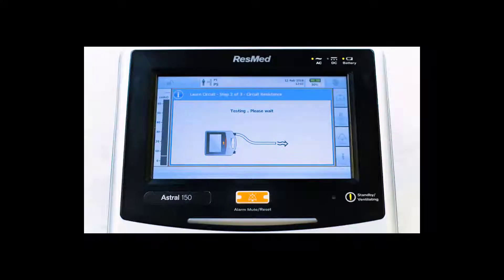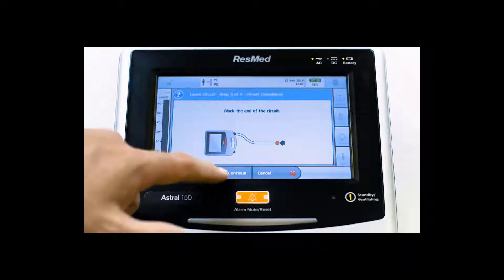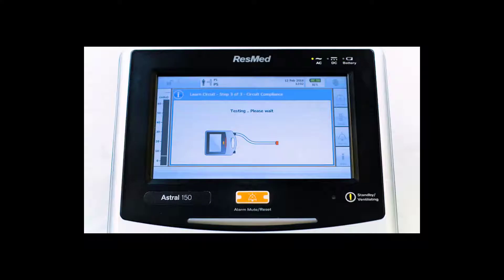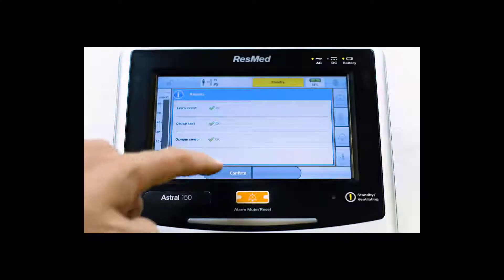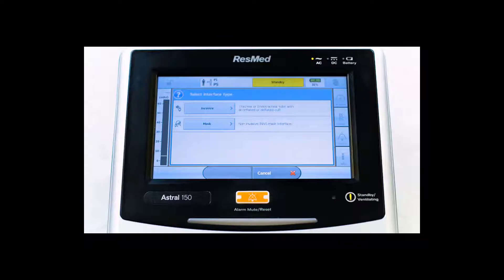Step 3: Now block the end of the circuit and select Continue. If all areas have green checkmarks, the learned circuit is completed successfully. Select Confirm.